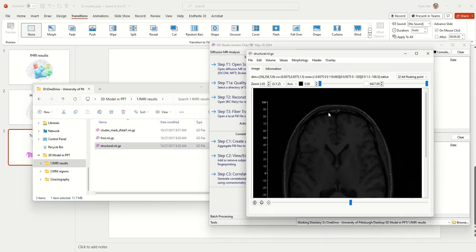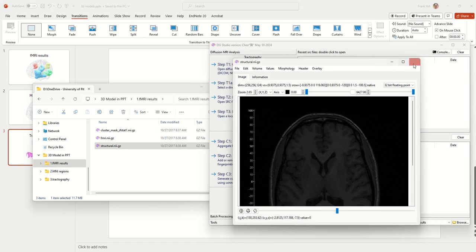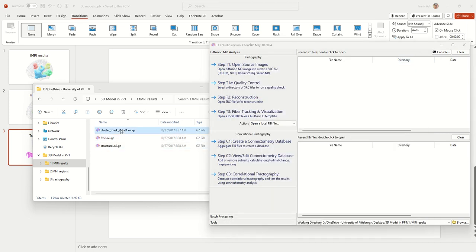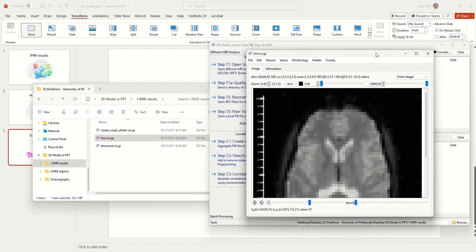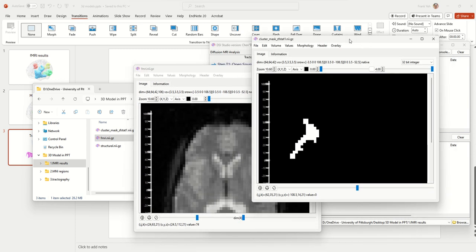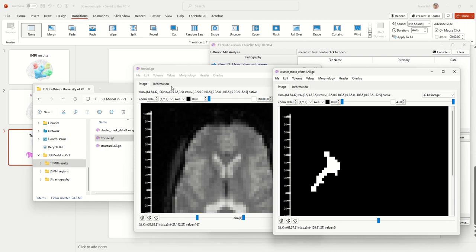The structural image usually has a much higher resolution, and this space difference will be important when we create those 3D models. You also need to make sure about the results space — it could be either in the native space, the same as the functional MRI, or in the MNI space. For this first part, the functional MRI results are in the native space, as you can see the dimension and resolution matches the original functional MRI data.